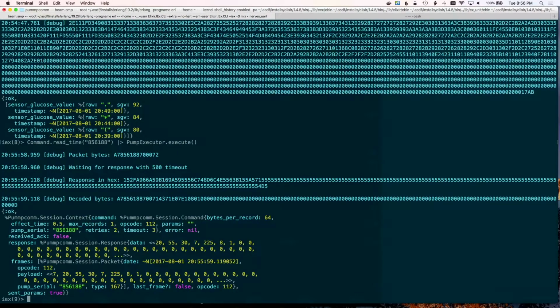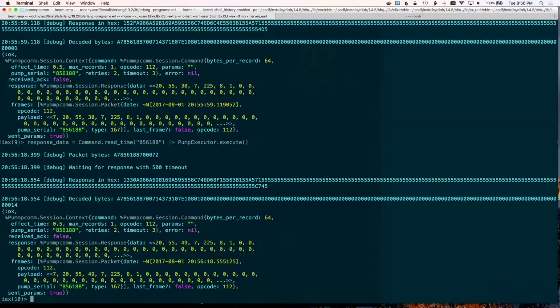It looks like I read the time, and I got back this data, and I have absolutely no idea what that is. So awesome. So here I can kind of parse out. I've gotten this sort of weird superhero ability to look at this data and see what it means without having to do a lot of decoding to it. That's both good and bad, because I feel like I could use that power some other way more usefully. But anyway, A7 is the hex for CareLink, which is the MiniMed protocol.